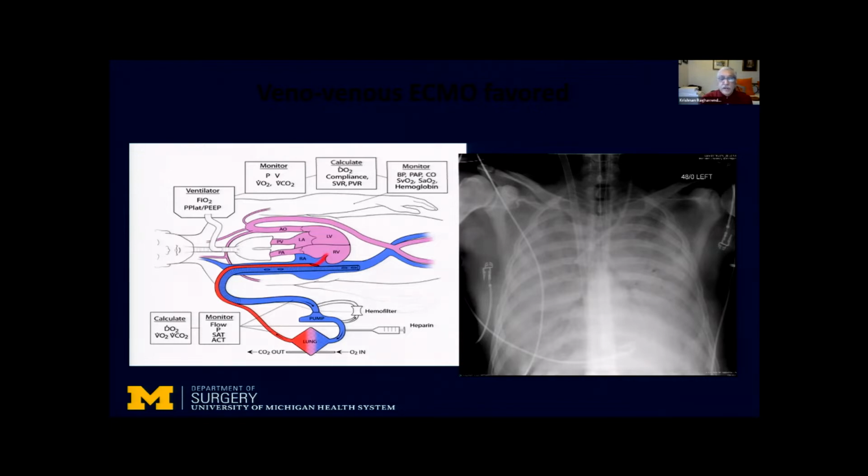We do not have the capability to do a bedside Avalon insertion because the fluoroscopic units and the radiation protection that is present in the ICU is not robustly developed in our ICUs. So that's why we prefer doing the Avalon cannulation in the operating room.